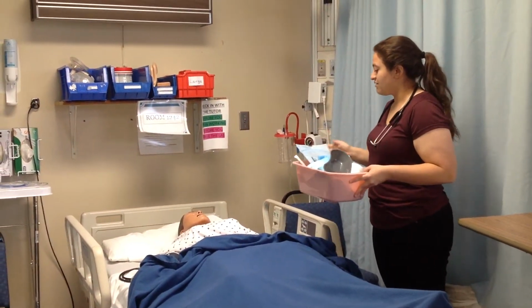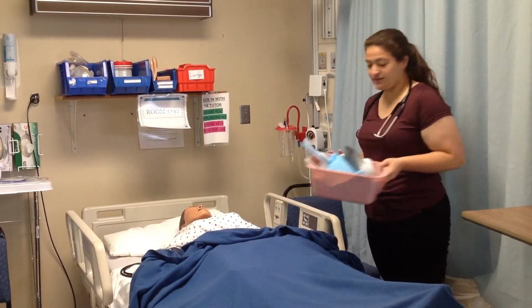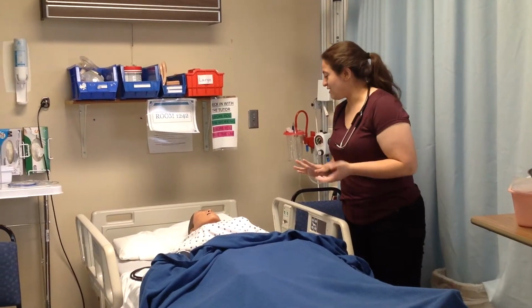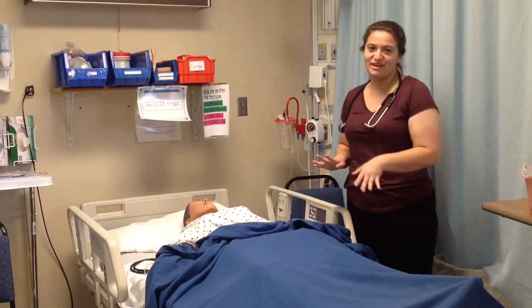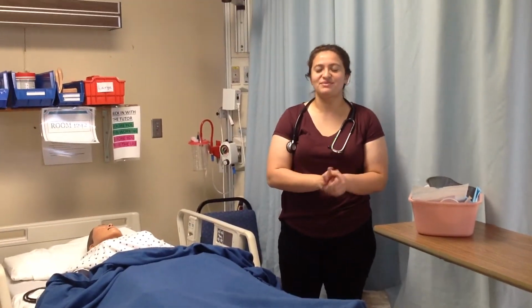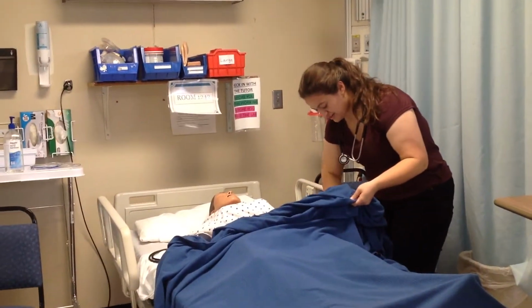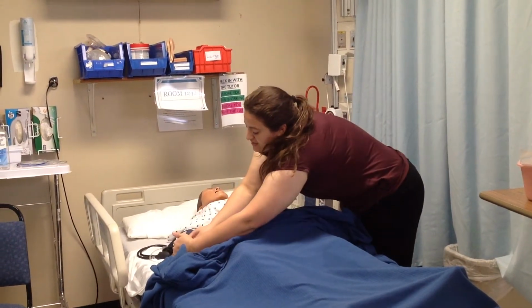And so first things first, I would go ahead and explain to the patient. So first I'm going to go ahead and identify you. First, I would make sure to have performed hand hygiene before actually performing any contact with the patient. So even before coming into the room, I would go ahead and perform hand hygiene, and I'd let that dry. And then I would go ahead and identify the patient. So I look for an ID bracelet. So here's the ID bracelet.